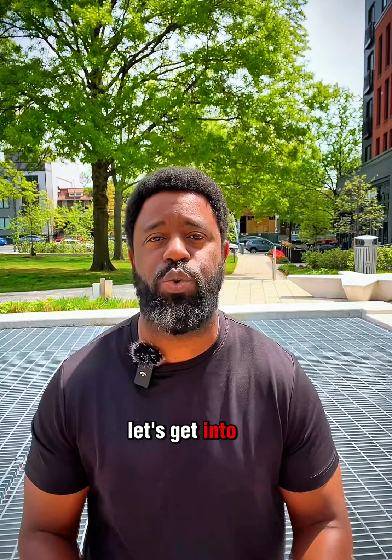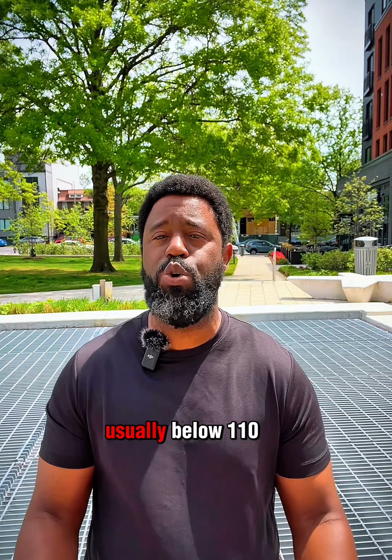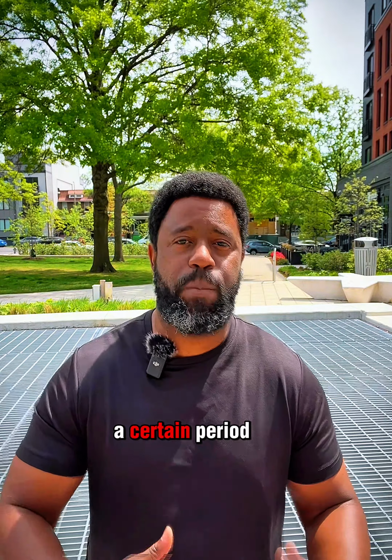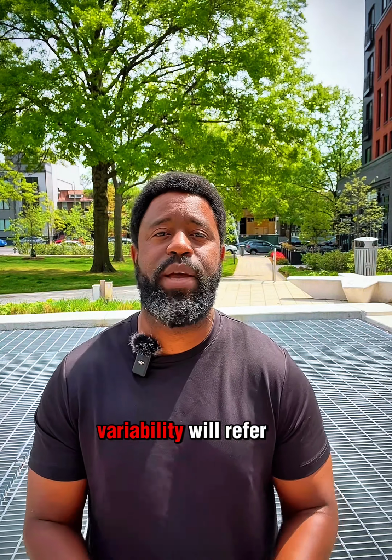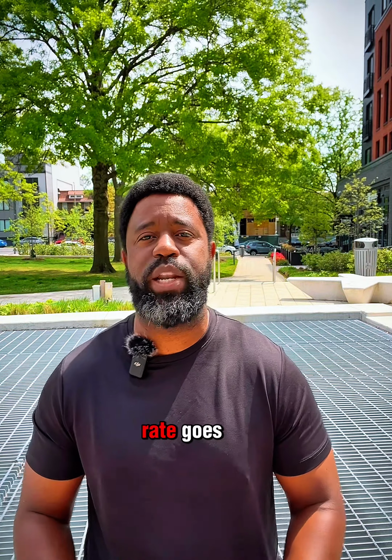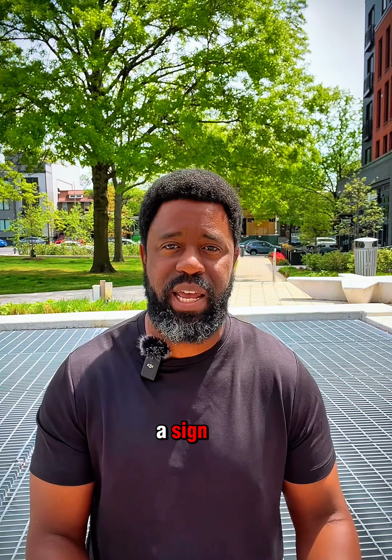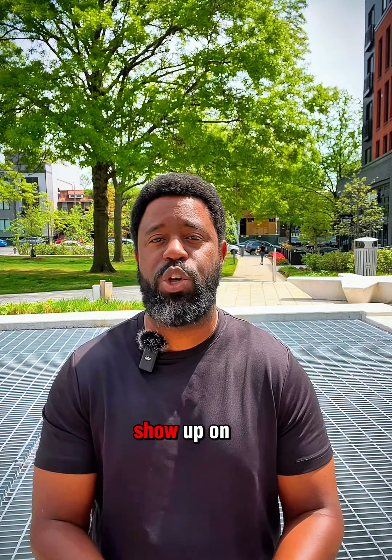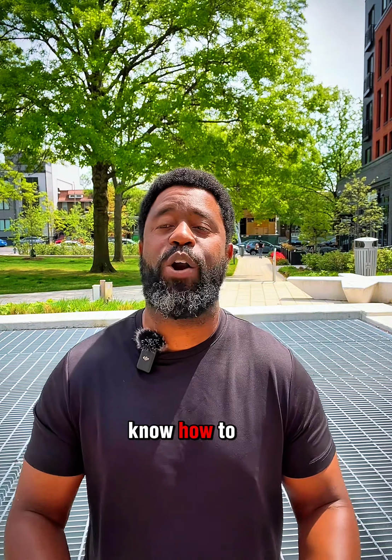Let's get into it. Bradycardia means that your baby's heart rate dropped below normal, usually below 110 beats per minute. And if it stays low for a certain period, continuously, that can be a red flag. Variability refers to how much your baby's heart rate goes up and down. And when it's minimal or absent, that can be a sign that the brain is not reacting the way that it should. These patterns can show up on the monitor, and trained medical professionals are supposed to know how to respond to all of this. They have training in this.